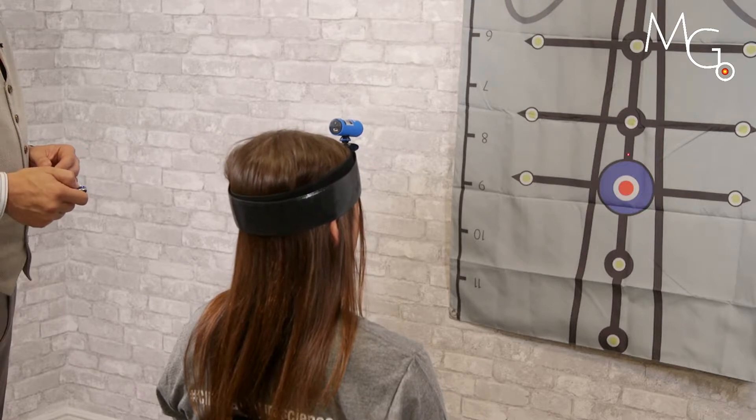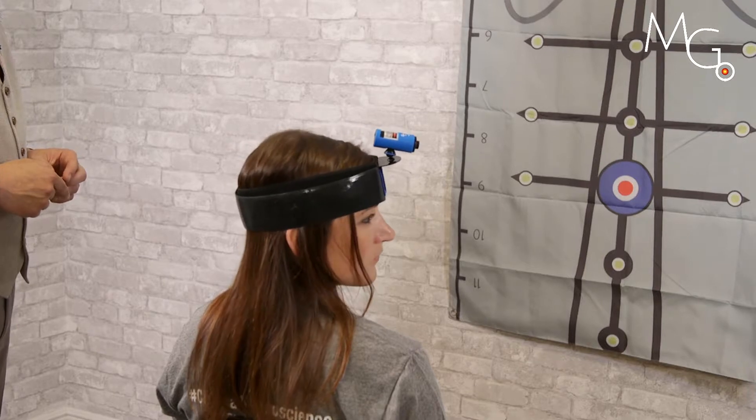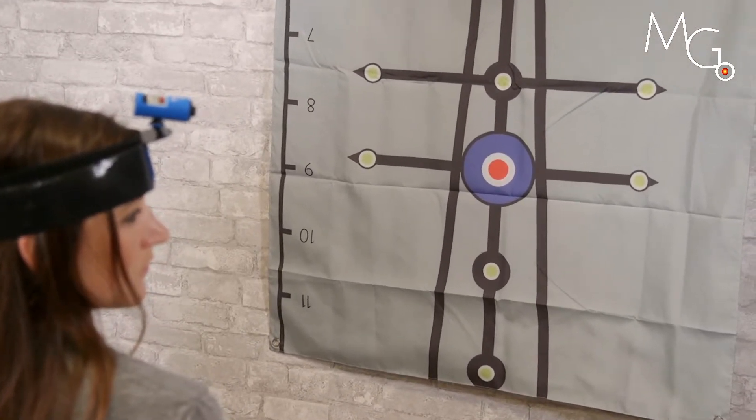A total of six trials are performed. Three or more trials outside the standard deviation is considered positive for a position sense error.